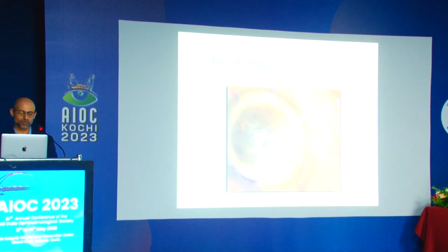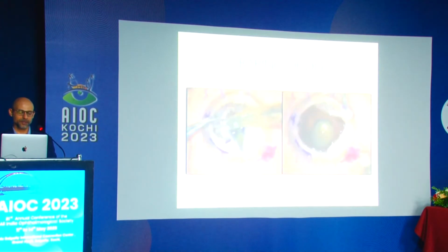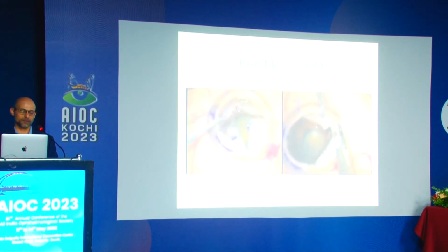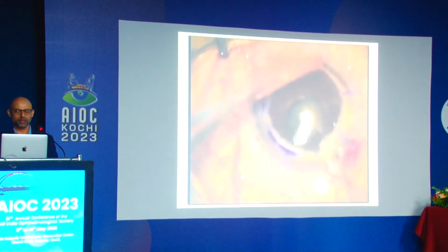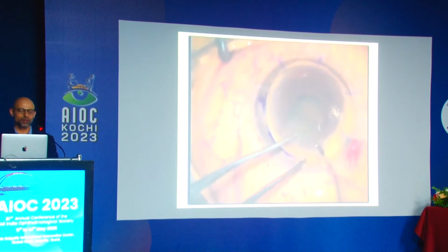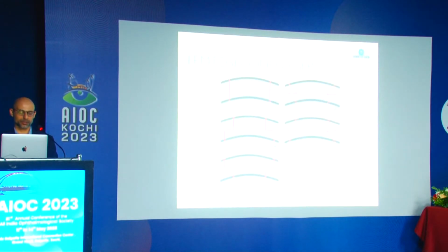So once you get a bubble, you remove some anterior stroma, and you can puncture the bubble like so. It's called a Brave slash. After that, if you want, you can introduce a viscoelastic in the interface. It's not mandatory to do this, and then essentially you are dividing the stroma into four pies, and then you just excise them with a blunt tipped scissor like is being shown here. Then you go to your button, refine to size, peel the Descemet's membrane off it, and then you put your button in the bed and suture it with whatever technique is comfortable for you, interrupted, continuous.